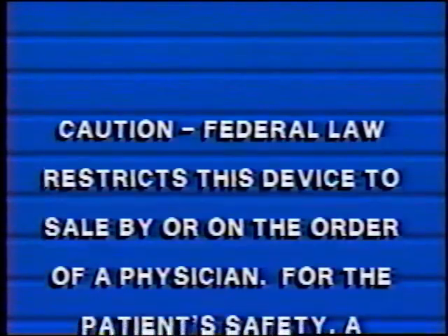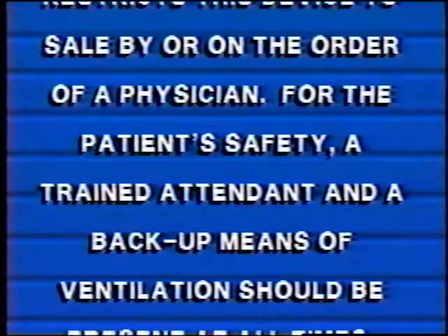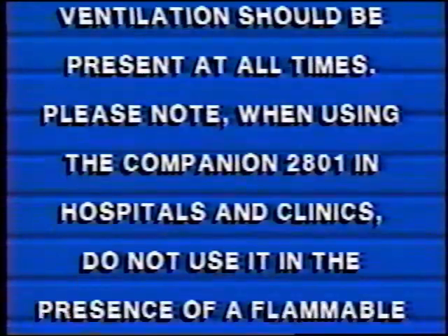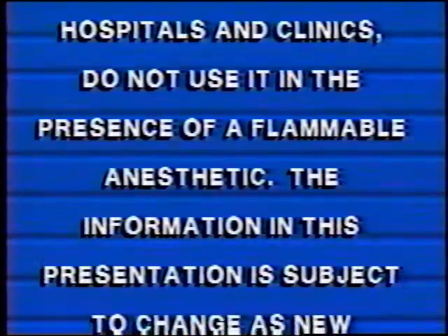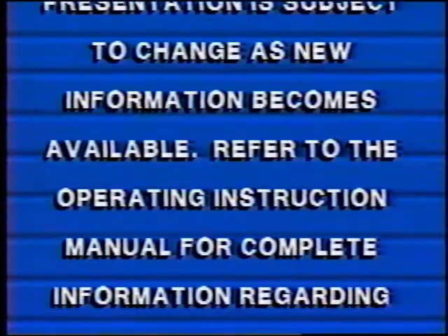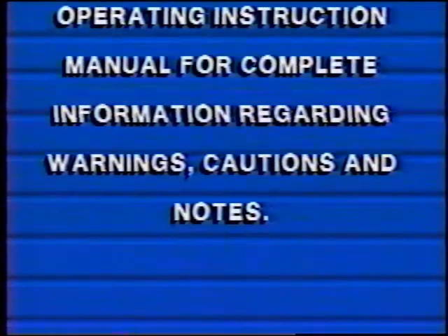Caution: federal law restricts this device to sale by or on the order of a physician. For the patient's safety, a trained attendant and a backup means of ventilation should be present at all times. Please note, when using the Companion 2801 in hospitals and clinics, do not use it in the presence of a flammable anesthetic. The information in this presentation is subject to change as new information becomes available. Refer to the operating instruction manual for complete information regarding warnings, cautions, and notes.